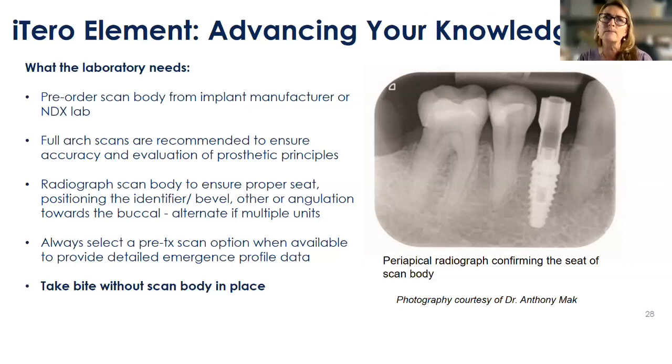Your assistants could. So full arch scans are highly recommended for implant cases, especially if it's more than a single tooth, right? And I really try to explain why taking a radiograph of the scan body in place is super important. We really want to make sure that that scan body is seated properly and accurately before moving on with the scan. And the way to check that is through an X-ray.